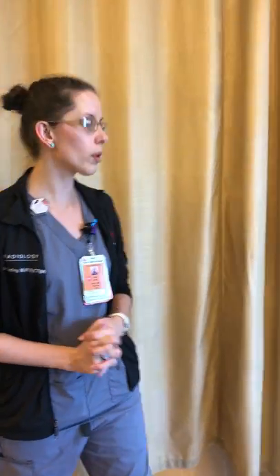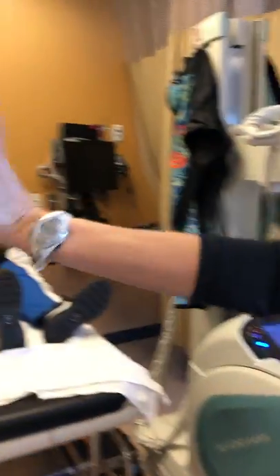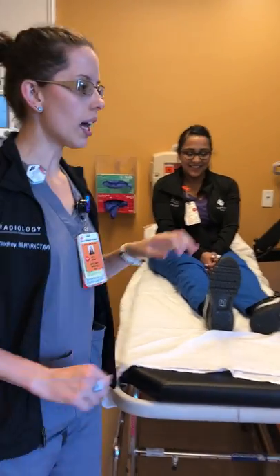Hello, my name is Leslie Jones and I'm one of the radiology clinical educators here at Texas Children's. I'm here to review positioning for knee x-rays. We're going to cover the AP, the lateral, and the sunrise patella view that we use here at TCH.